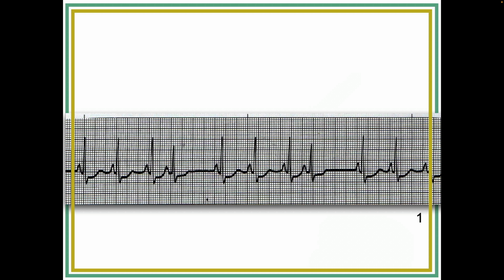So if the premature beat does hit a regular pattern, sometimes it does, sometimes it doesn't, then you could say it's regularly irregular. So it definitely won't always fire at the exact same time. I guess that's my question. Sometimes the same time, sometimes not, as you're going to see when we do premature beats, there's all kinds of patterns.